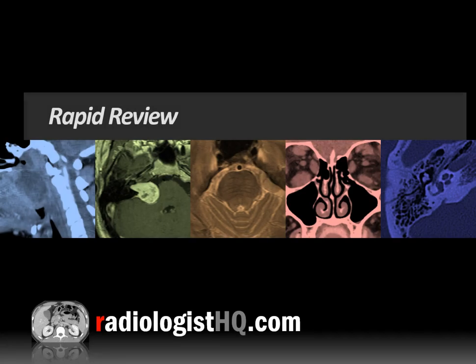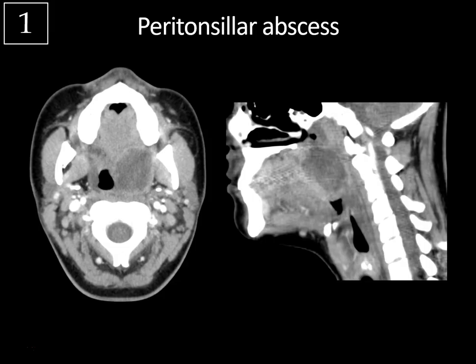Rapid review: Case 1, the peritonsillar abscess — we're in the pharyngeal mucosal space at the level of the oropharynx. It's a complication of tonsillitis with abscess formation in the peritonsillar space. Look for complications including extension into other spaces like a retropharyngeal abscess, thrombophlebitis of adjacent veins like the internal jugular vein, and airway compromise. Look for displacement of the fat-containing parapharyngeal space as a clue to nearby abnormality.